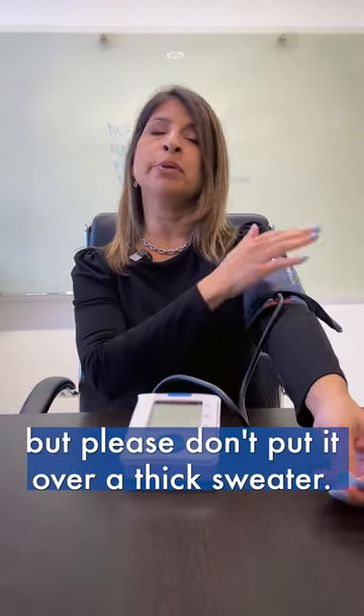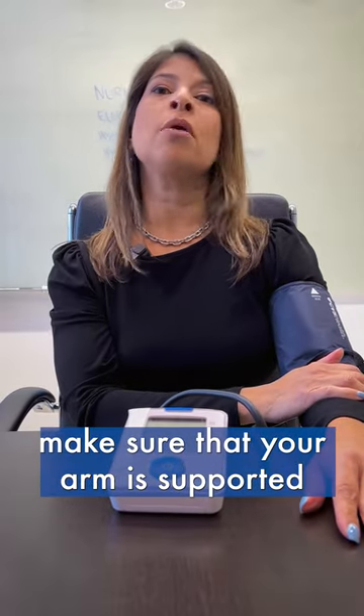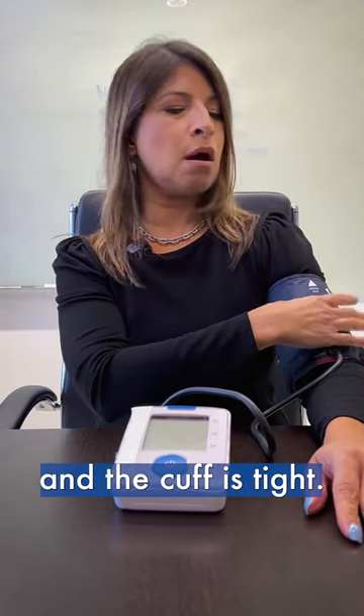I'm putting it over my shirt because this is very thin, but please don't put it over a thick sweater — if that's the case, please roll your sleeve up. Once you are comfortable, make sure that your arm is supported and the cuff is tight.